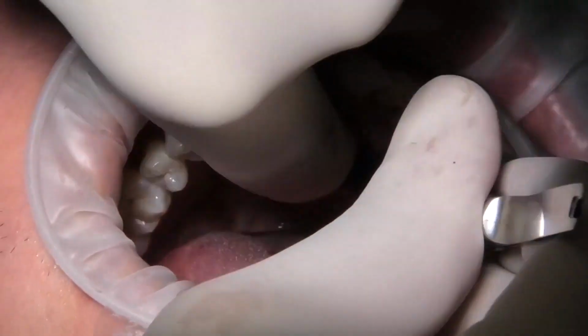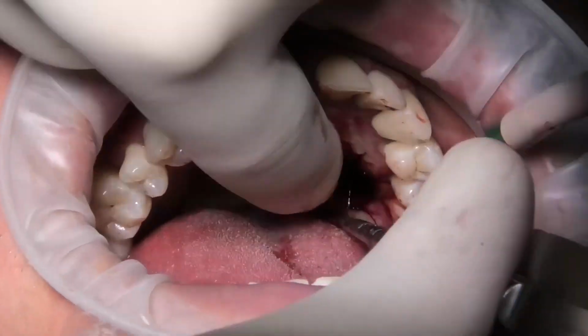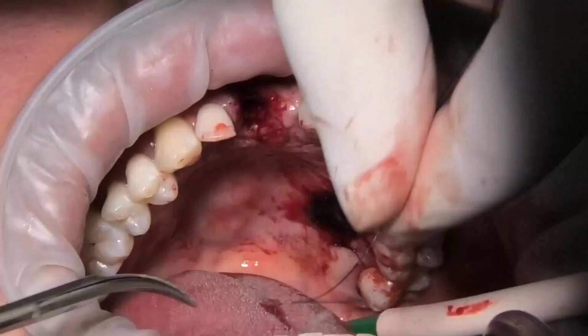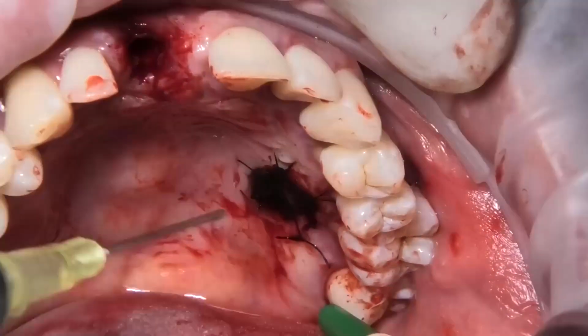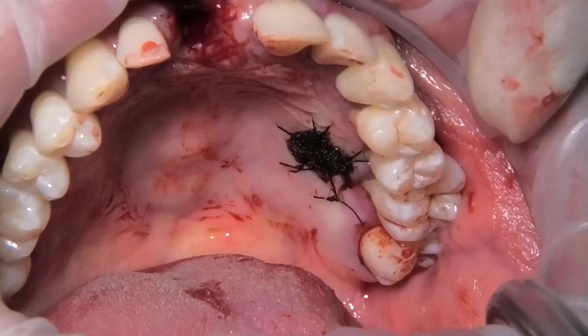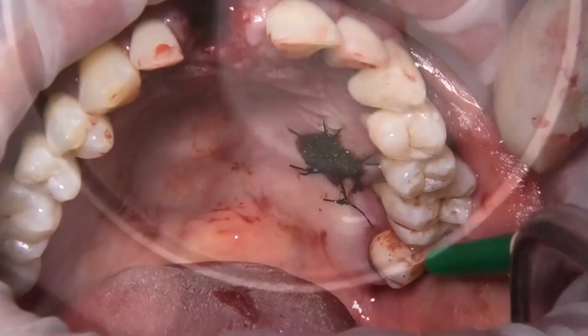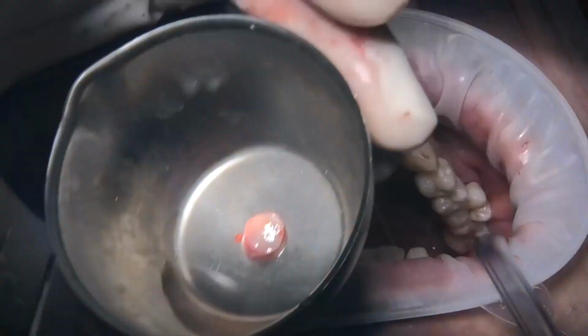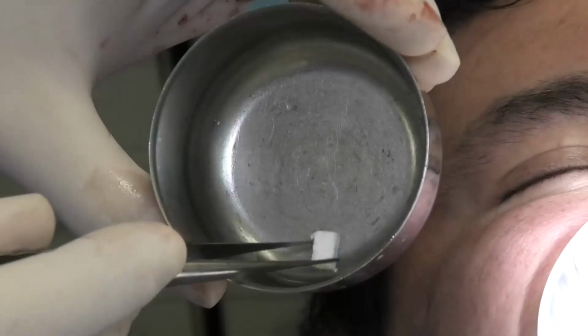Okay, after this, I think we have finished, and we have done cross stitches suspended from the teeth, and so we have obtained the correct hemostasis of the palate immediately. So this is the palatal punch, and now we start the second phase of our surgery with ridge augmentation.